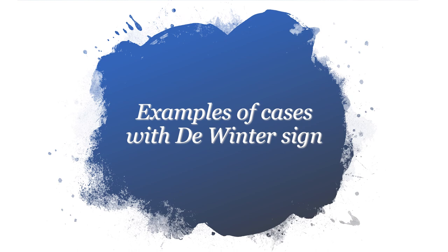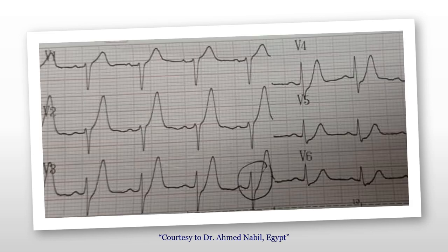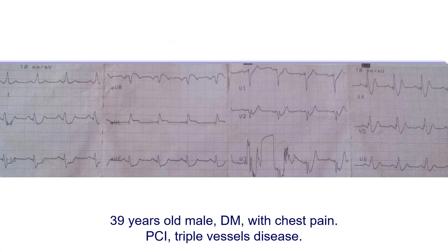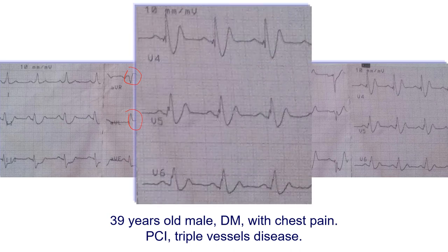Here are some examples of the De Winter sign. In the first case, we can clearly see ST elevation in AVR and the De Winter sign in V2, V3, and V4 — ST depression, upsloping ST segment, followed by a tall symmetrical T wave. Another example from Egypt shows the same pattern clearly. A third example from Egypt involved a 39-year-old diabetic male with chest pain, showing ST elevation in AVR and AVL, and the De Winter sign in V4, V5, and V6.